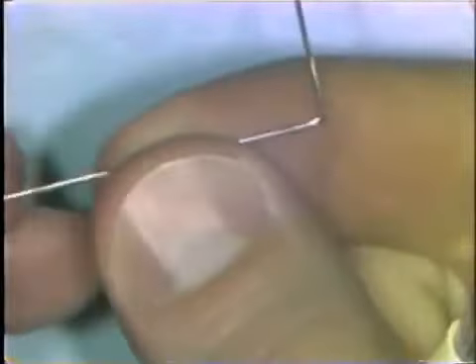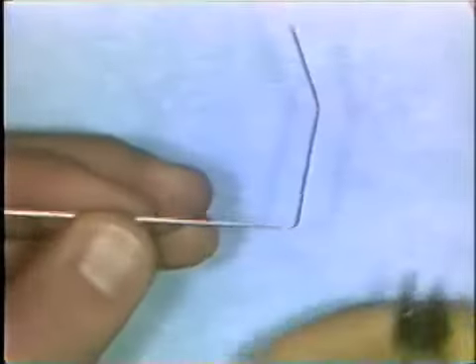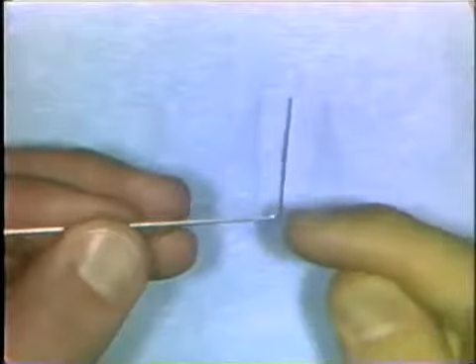There are some problems you should avoid in making right angle bends. Don't make the bend too large. If you use too large a section of cross-section of the round beak of the plier, the right angle bend that you'll make will be more of a curve than a sharp bend, and you may not achieve the accuracy that you want.